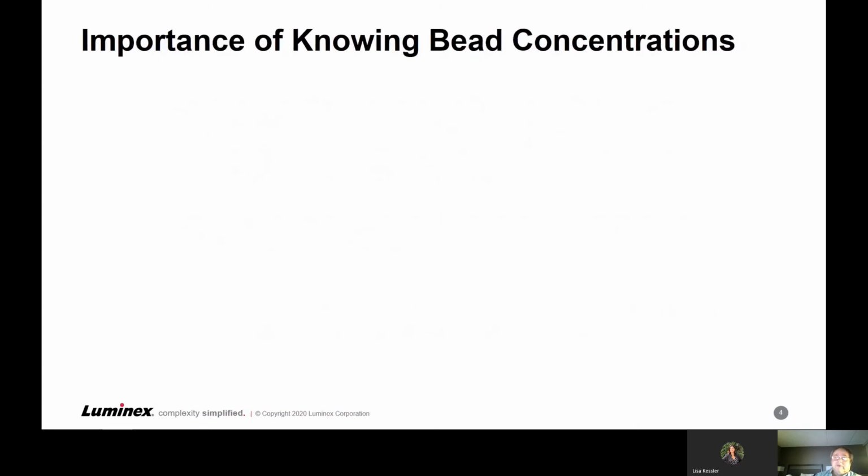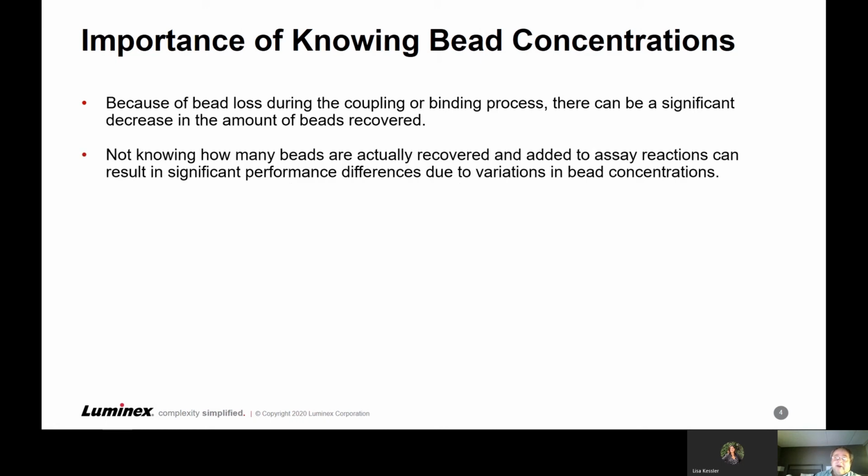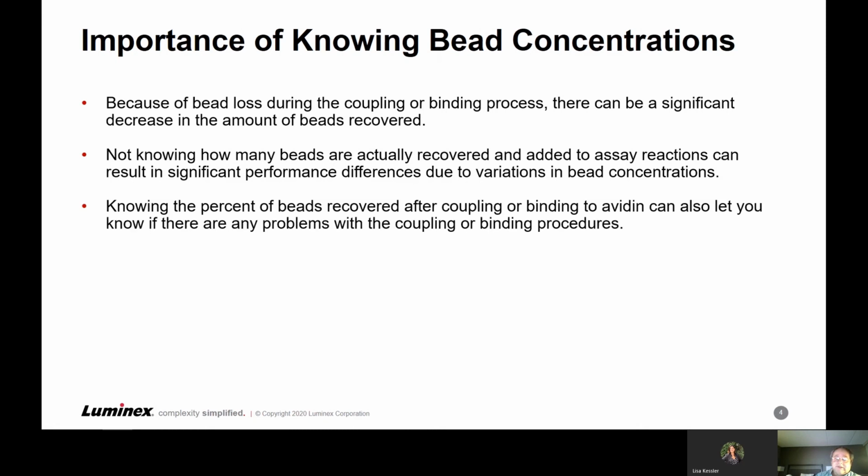So what's the importance of knowing bead concentrations? Well, because of bead loss during the coupling or binding process, there can be a significant decrease in the amount of beads being recovered. So not knowing how many beads are actually recovered and added to assay reactions can result in significant performance differences due to variations in bead concentrations in the assays.